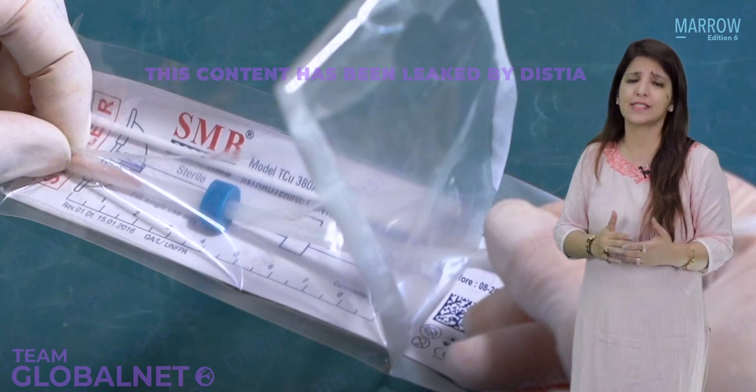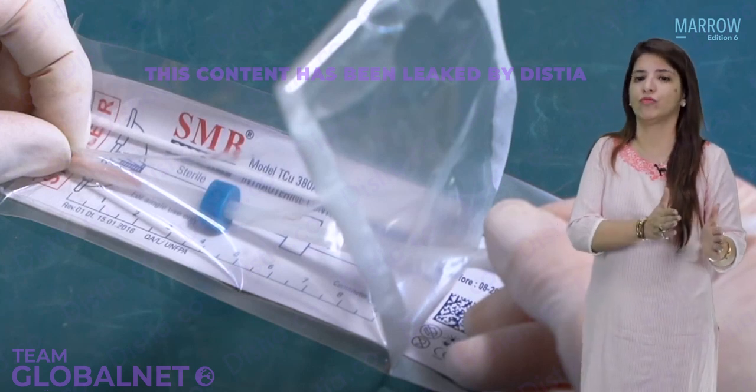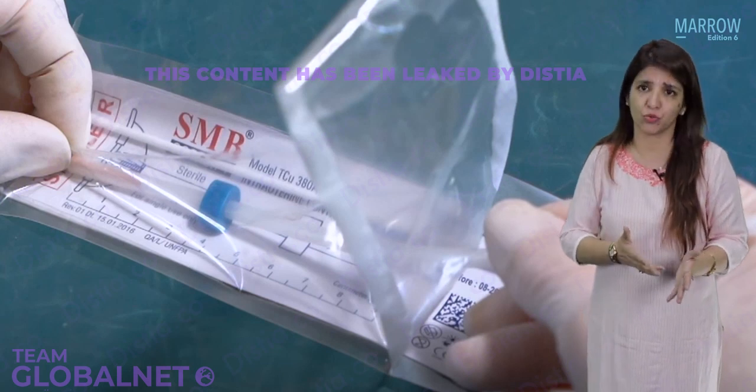Now once I've done this, I have to adjust the length of the inserter rod equal to the length of the uterine cavity, or equal to the depth of the uterine cavity.